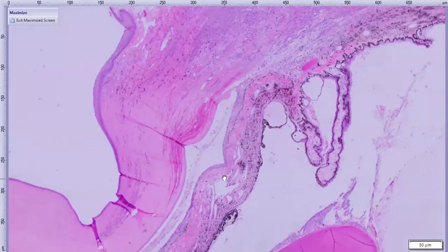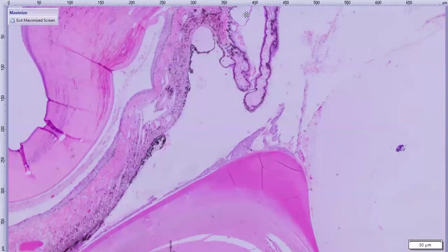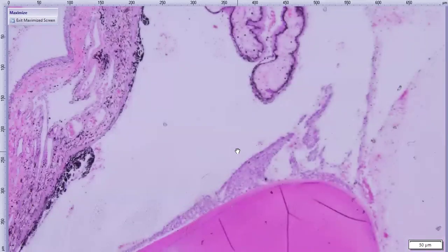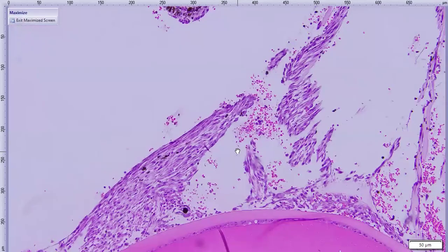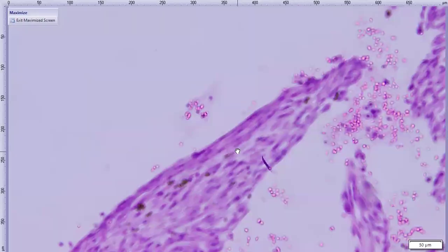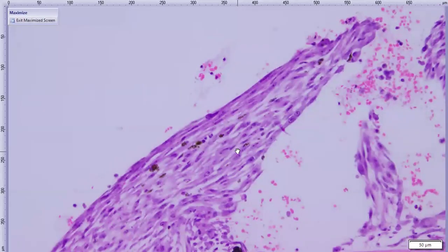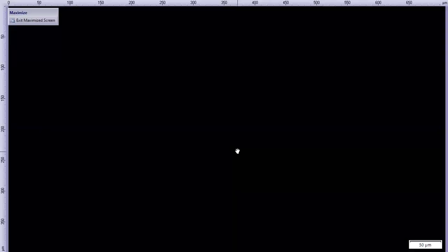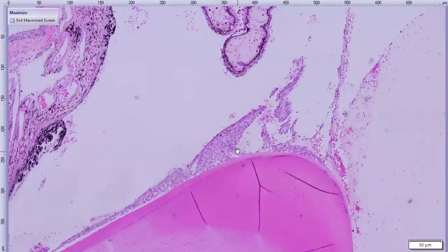The cells do occasionally carpet surfaces. So these cells that are on the surface of the lens are neoplastic cells, in my opinion at least. And whenever we see carpeting in the eye, we think metastatic disease, which I'm already pretty convinced of. But this pattern of carpeting is spot on for at least metastatic disease to the eye from the ophthalmologist and ocular pathologist perspective.